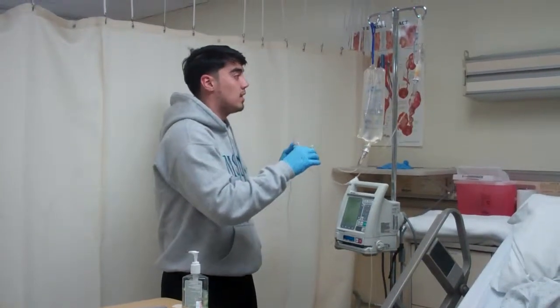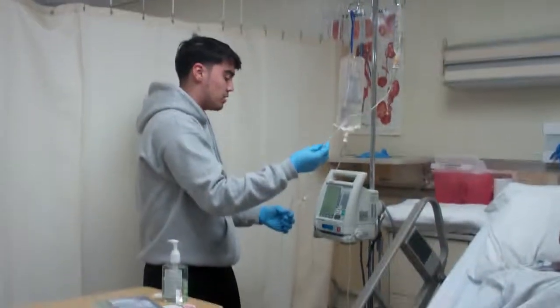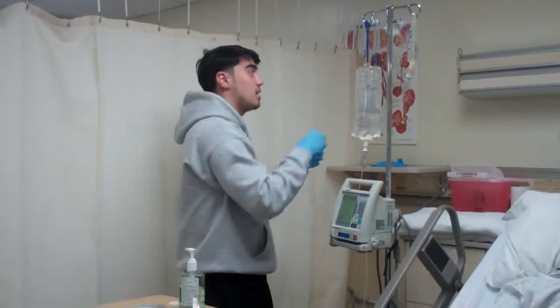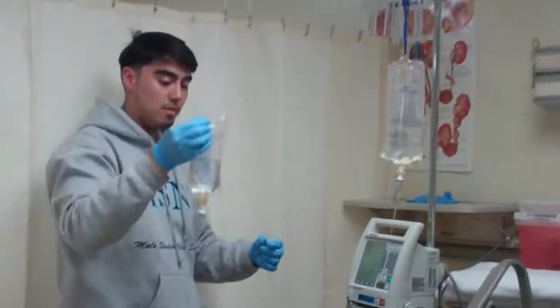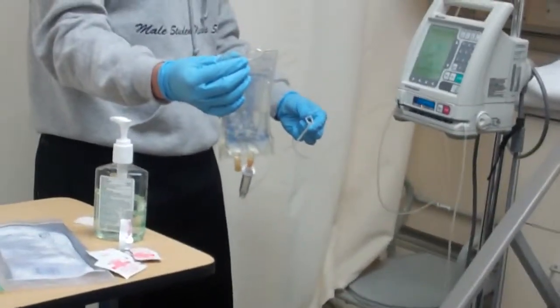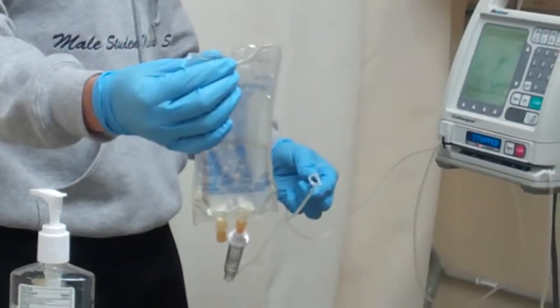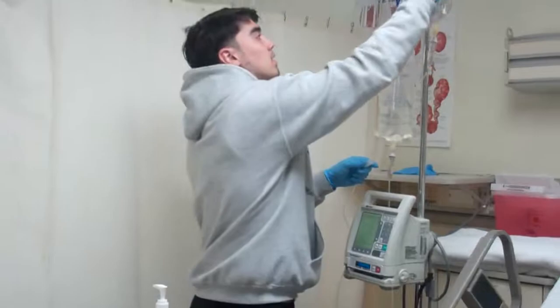So now that we've connected it, obviously the line is still clear. What we want to do next is some back priming since the medications are compatible. We're going to take our medication, and then we're going to lower it and allow it to back prime via gravity. So you see the bubbles, which means that it's back priming. Perfect. Let's go ahead and close it.